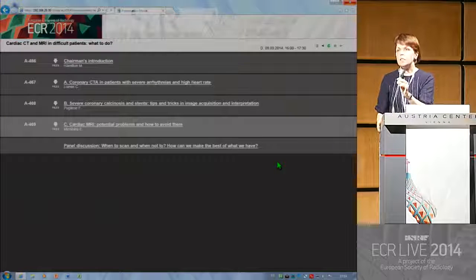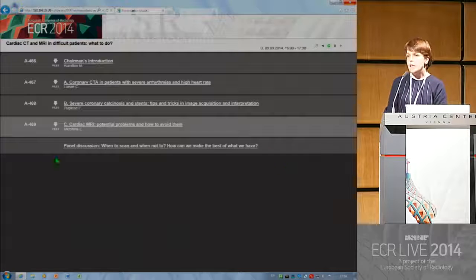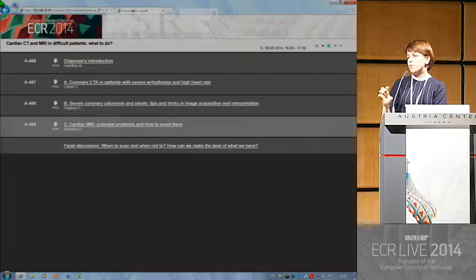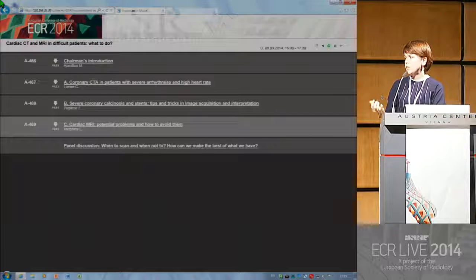Thank you for the question. It depends on the clinical issue. Sometimes when we deal with acute inflammation, we use early enhancement, and we may start immediately after contrast, 3-5 minutes. Another case when we use 5 minutes timing after contrast injection is patients with hypertrophic cardiomyopathy, because different stages of fibrosis are differently visualized at different time points, 5 minutes and 10 minutes. But for patients with post-ischemic fibrosis, the usual start time is 8 to 10 minutes.